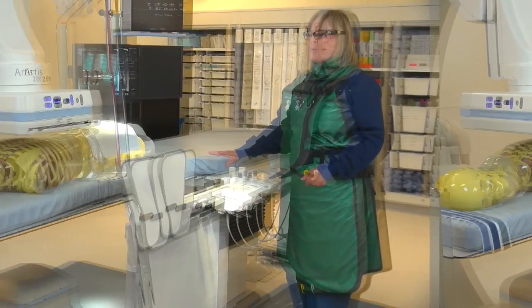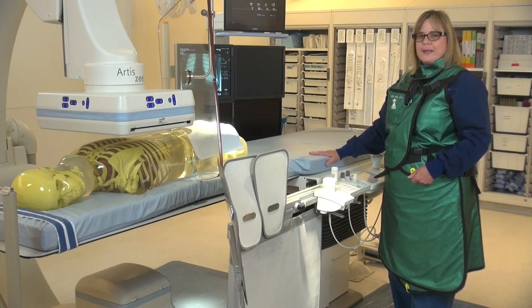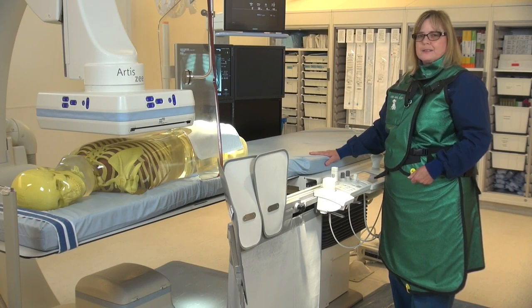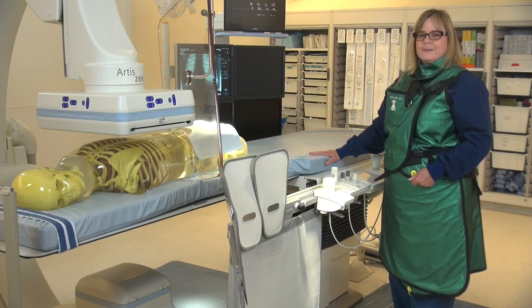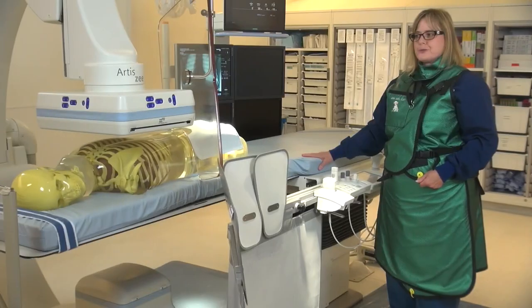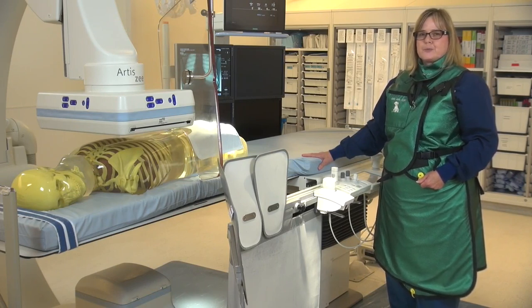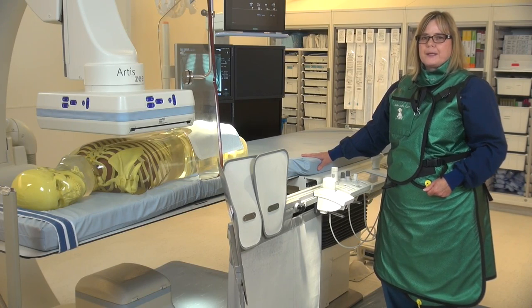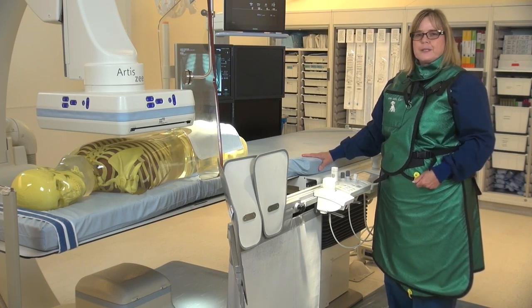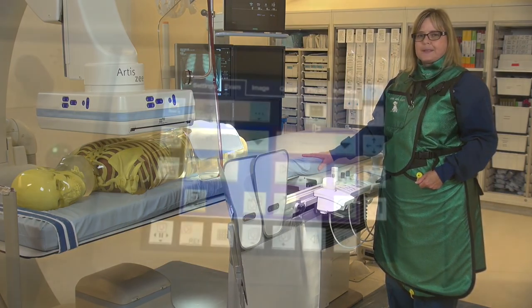Anything we can save under the store fluoro mode is a good way of saving dose for the patient. We like to use the store fluoro mode when we're looking at the LVgram or when we're placing the closure device in the right femoral artery — at those times we don't need to use acquisition. Our doses in the cath lab are a lot higher than in interventional radiology or regular diagnostic fluoroscopy because we do use higher frame rates, up to 7.5 or even 15 frame rates and pulse sequences.